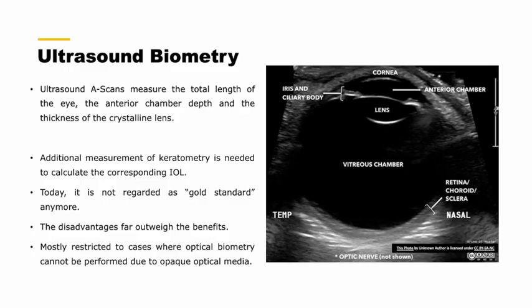This procedure should only be performed by experienced personnel. Today, it is not regarded as a gold standard anymore. The disadvantages far outweigh the benefits. Today, ultrasound biometry is mainly restricted to cases where optical biometry cannot be performed due to opaque optical media.